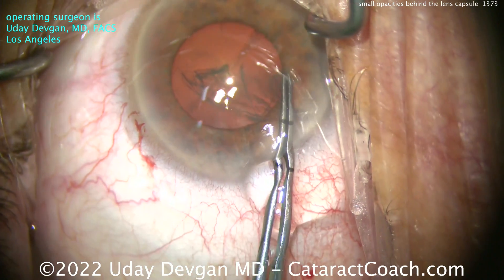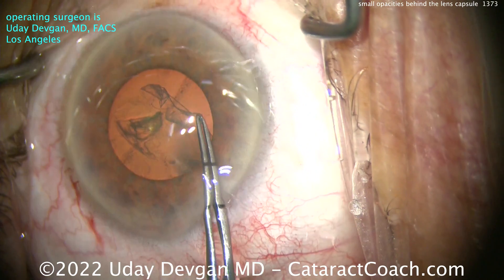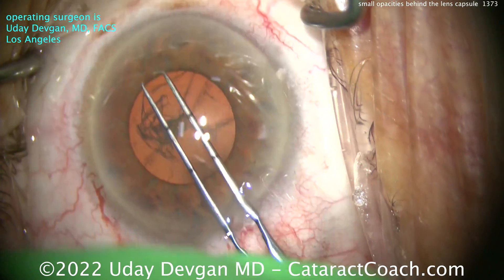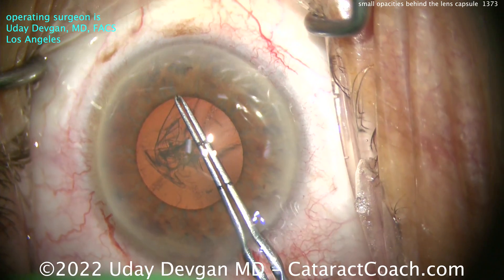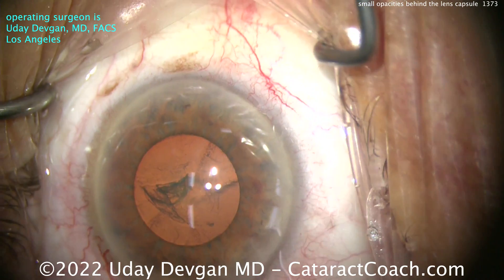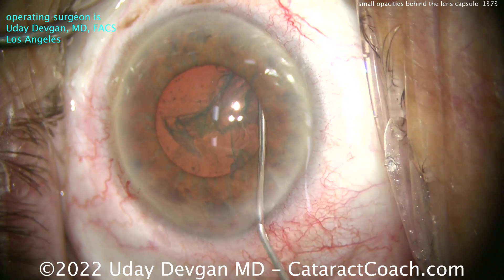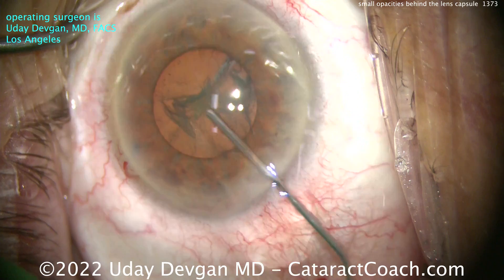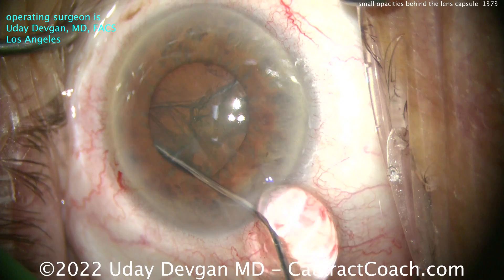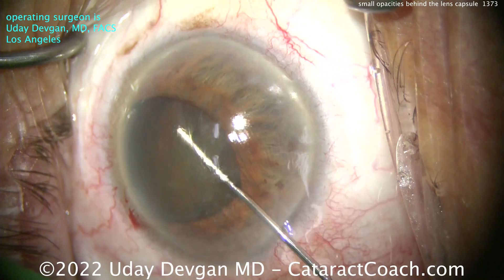This patient doesn't have any history of trauma that he can recall, so the rest of the case should be pretty reasonable. What I wanted to show you is that in this case, the barrier between the anterior segment of the eye and the posterior segment of the eye is not all that strong. We know it's the posterior capsule, but it's also the zonular support. With the zonular support, if there are gaps or holes or spaces in between the zonular attachments, you can actually get pieces of cataract going behind there.